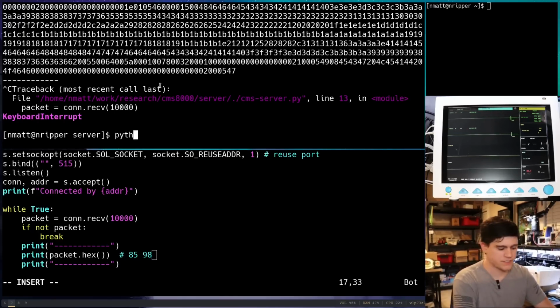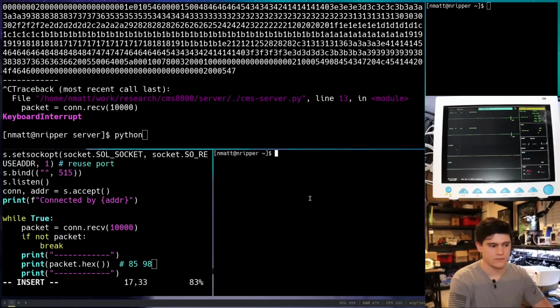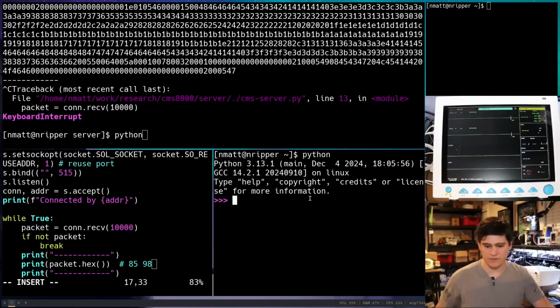Okay, let's open up our little, actually here, we can sneak a little Python terminal over here. And all I'm going to use this for is for math things. So 85, again, we just want to do hex of 85 right there. Okay, so we need to look for the 55 byte.